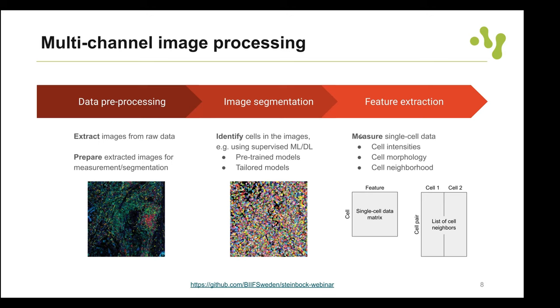This setup is usually the most complicated step — everything from here is just executing individual commands. Now with the Steinbock command defined, we can pre-process our IMC images. Here we apply hot pixel filtering, which removes individual hot pixels generated as technical artifacts by the Hyperion machine used to acquire these images.